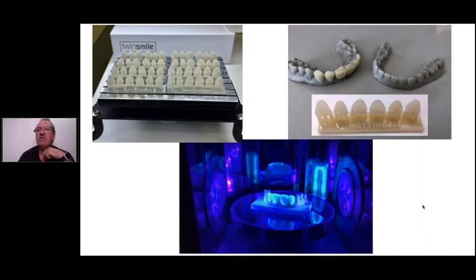We are looking at models like you see here. They are about 15 grams. So what we try to do is print everything hollow. And this is also something which many of the companies nowadays who are developing software or models with their software, many of them don't have the option to hollow the models out. And that's a problem. That's why our software for our printer has this function. But if you're using some other company's software, be sure that in future they make the software hollow out the model before you print it, because anything solid makes everything expensive.